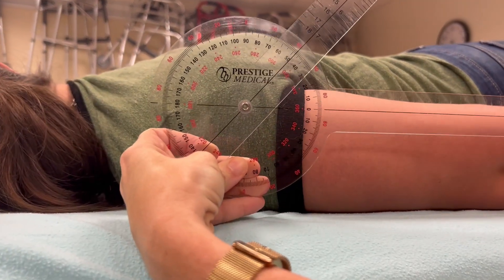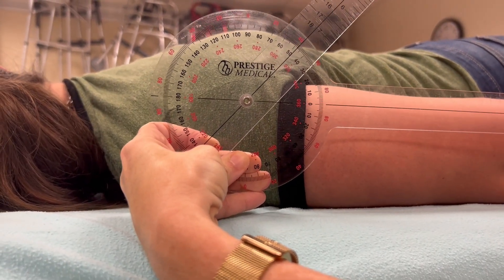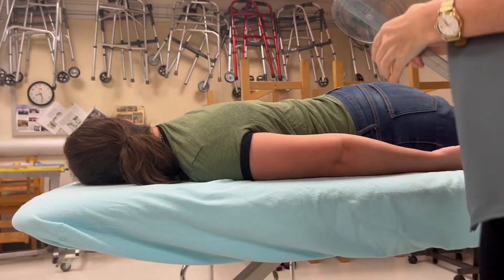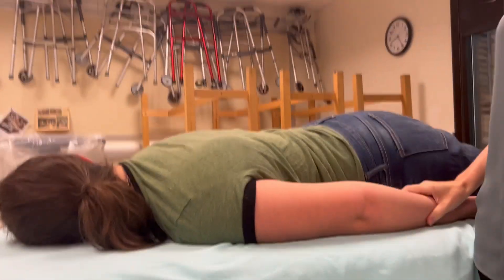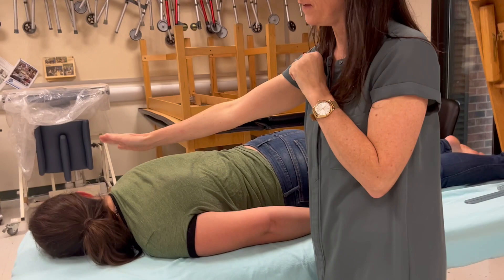Come on back down — that's difficult. It's 0 to 48 degrees for extension. For MMT the position changes, so instead of her facing away, she faces toward me.